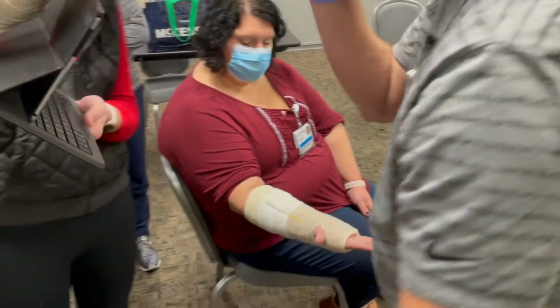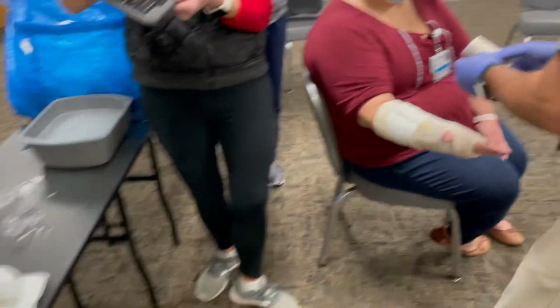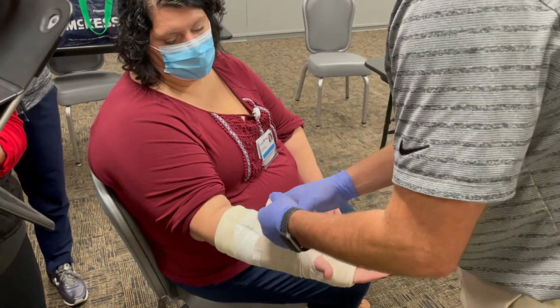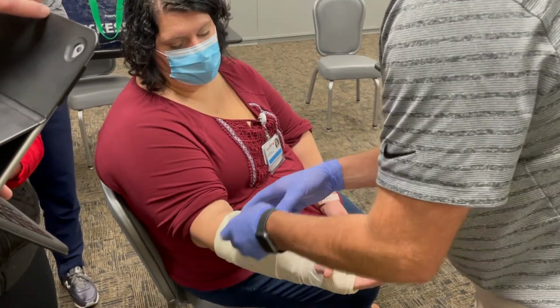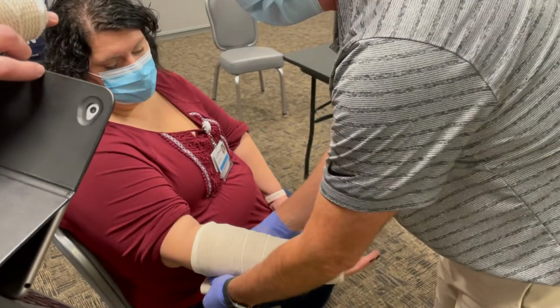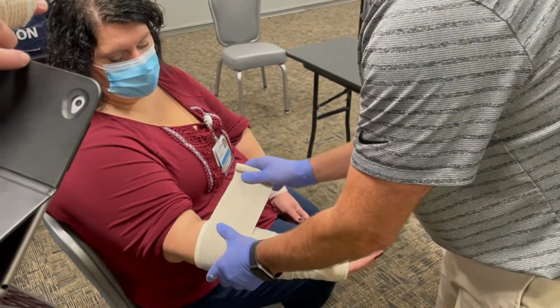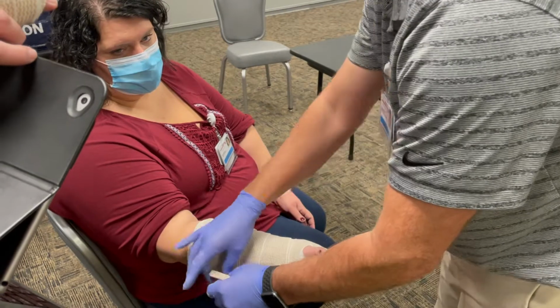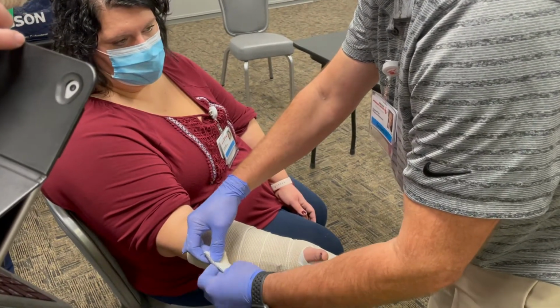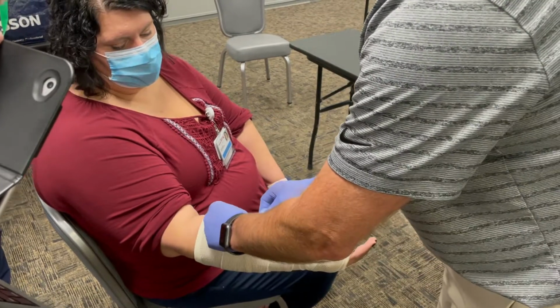Don't wrap tight too, by the way. I don't know if you can tell from the video, but I'm not pulling hard. I'm pretty much just laying that on there. You don't want to restrict their blood flow. Sometimes I put a little Coban over the outside of it if it's a peds patient, so I can see if they've been in it. You know, sometimes these kids take stuff off at home. If they take the Coban off, you kind of know, because it's all wrinkled and stuff.